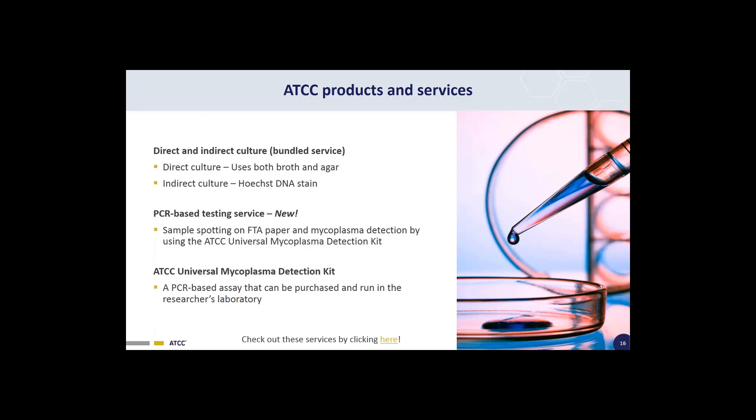Let's take a look at the products and services offered by ATCC to detect mycoplasma contamination. We offer all three types of mycoplasma detection methods: direct and indirect culture testing offered as a bundled service, where the direct culture uses both broth and agar and the indirect culture is a Hoechst DNA stain. Our newest service offering is a PCR-based testing service where cells are spotted on FTA paper and processed in our lab using ATCC's mycoplasma detection kit. The mycoplasma detection kit can also be purchased as a product on our website, allowing researchers to run the assay in their own lab.